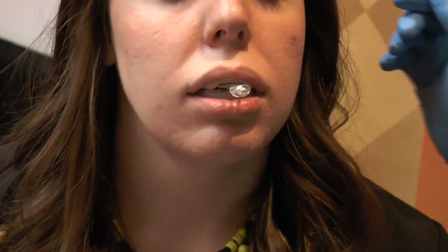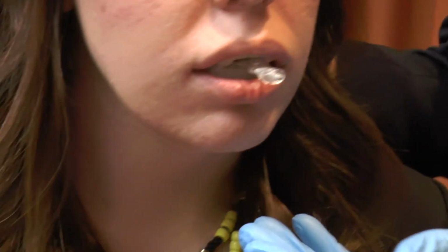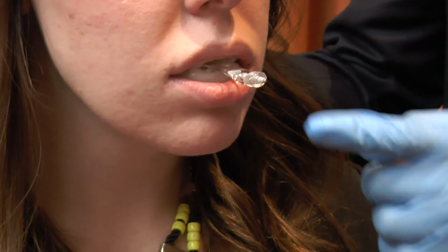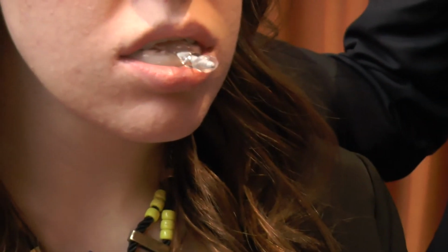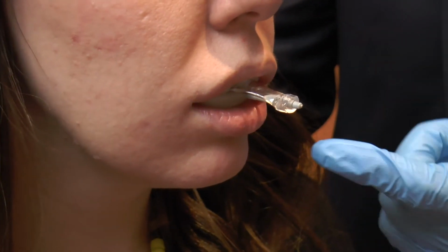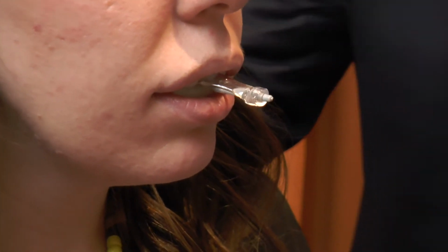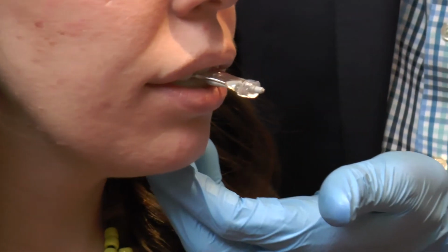Now, to determine how much to protrude our patient, what you're going to see here is I'm going to have the patient jet their lower jaw forward. And you can kind of get a sense of how much range she has. So this is maximum protrusion, and go ahead and slide it back. And this is kind of where we set the screw initially to assemble the apparatus. Most of the time, go ahead and slide your lower jaw forward.